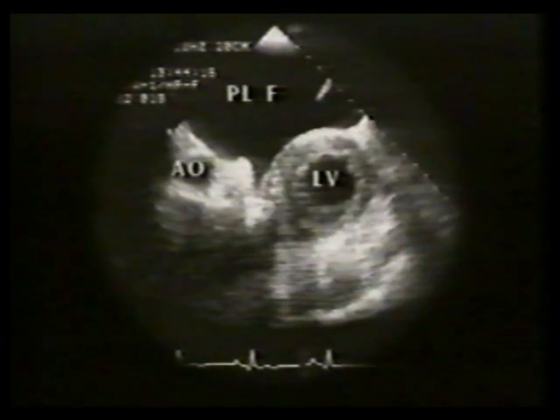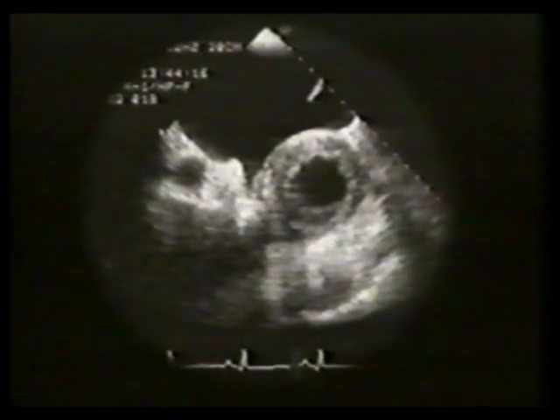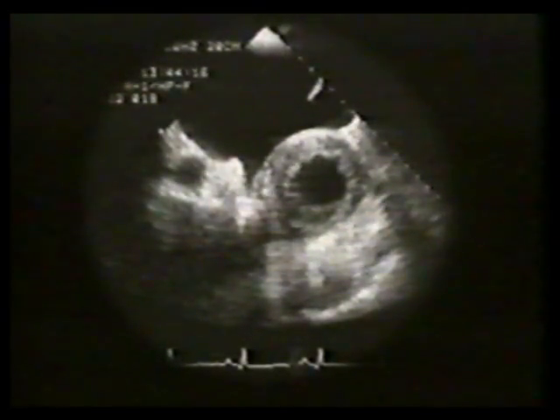This 57-year-old female with cardiomyopathy has a large left pleural effusion. Remember that pleural fluid, which is an excellent transmitter of ultrasound, creates a unique echo window for imaging the heart. The transducer has been placed on the patient's back near the lower border of the left scapula. Sound beams first traverse the pleural fluid.